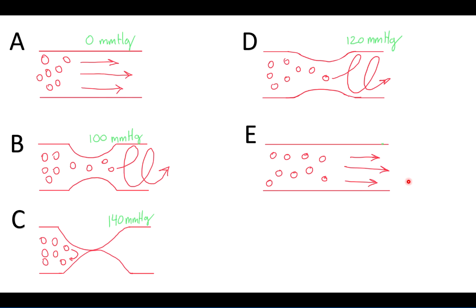At which point, the sound that we heard during that chaotic circular movement of the red blood cell goes away, we'll call this our diastolic blood pressure. At this point in our blood pressure test, we would be able to record the systolic and the diastolic value and then completely deflate the cuff pressure.